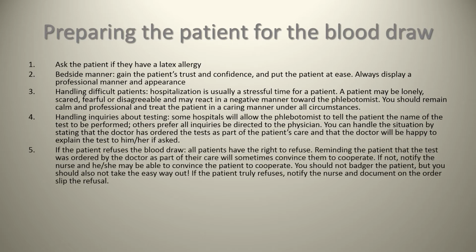If the patient refuses the blood draw, all patients have the right to refuse. I've had patients refuse a blood draw even for the formation of something like platelet-rich fibrin, which would benefit them in their surgical procedure. Reminding the patient that the test was ordered by the doctor as part of their care will sometimes convince them to cooperate. If not, notify the nurse and he or she may be able to convince the patient to cooperate. You should not badger the patient, but you should also not take the easy way out. If the patient truly refuses, notify the nurse and the doctor and document the refusal on the order slip.